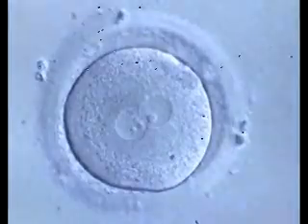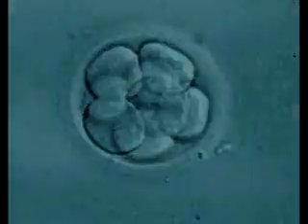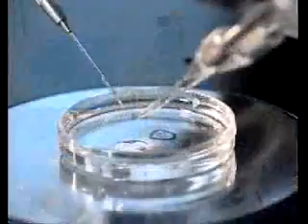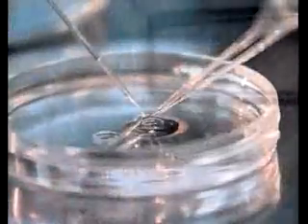Embryos fertilized in vitro are left to develop over 3 days, considered to be the period required for analysis. 1 or 2 cells are extracted from the embryo by performing an embryo biopsy. However, this does not compromise normal development.